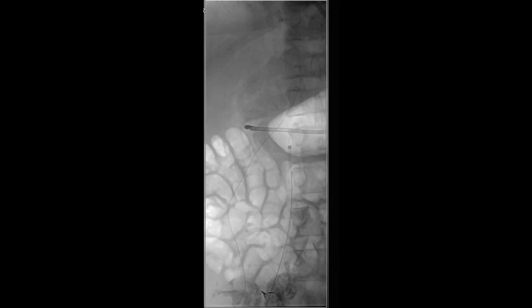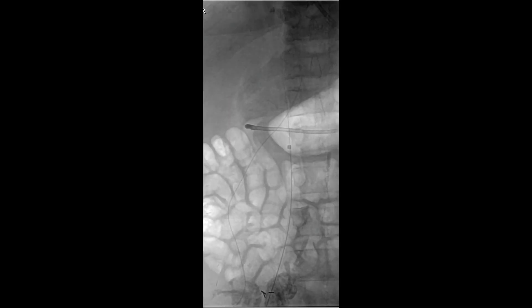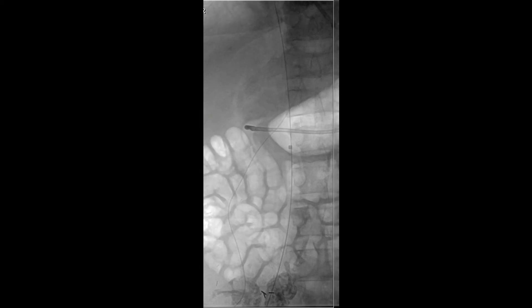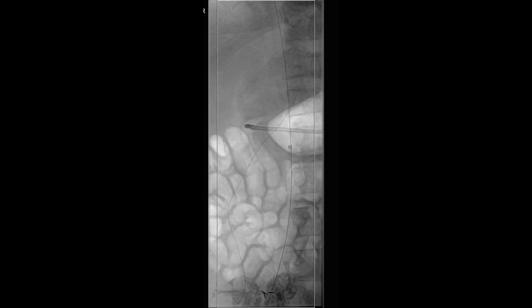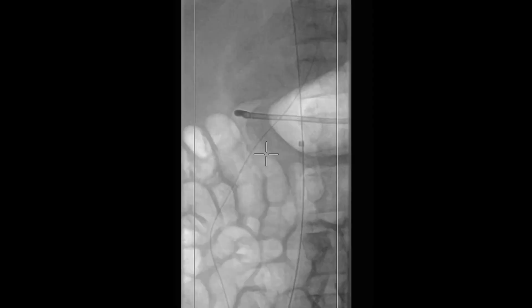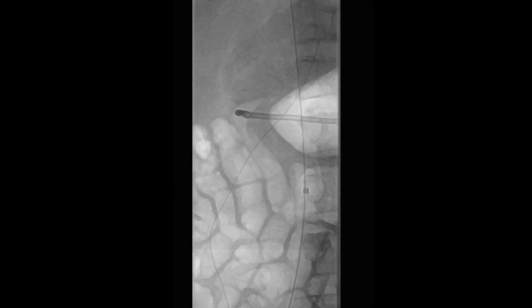We access the common femoral vein in a standard fashion with a mini stick needle followed by the wire micropuncture sheath. We then advance a wire into the inferior vena cava and a sheath is introduced.